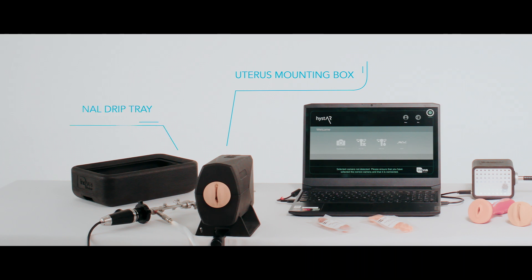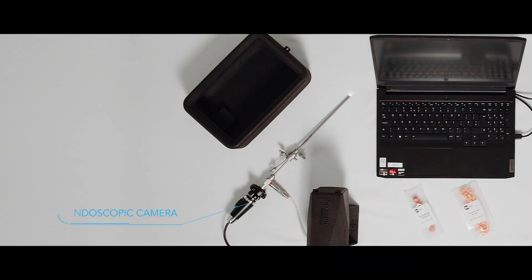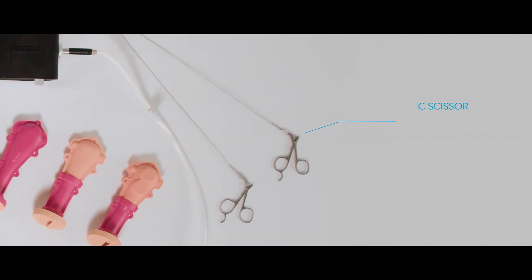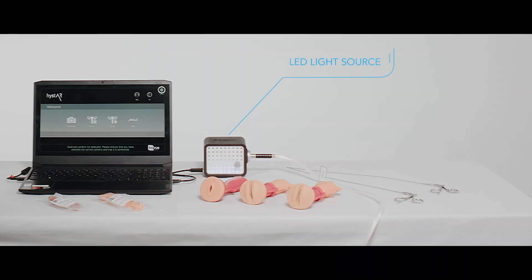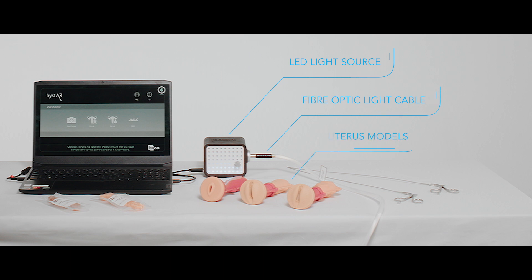With optional drip tray, the InnoVis endoscopic camera system, a hysteroscope, hysteroscopic scissors, biopsy forceps, the Bazzini LED light source, fiber optic light cable and your choice of pathological uterus models.